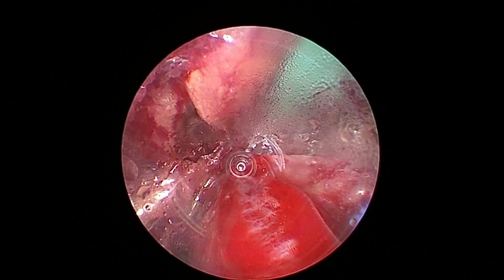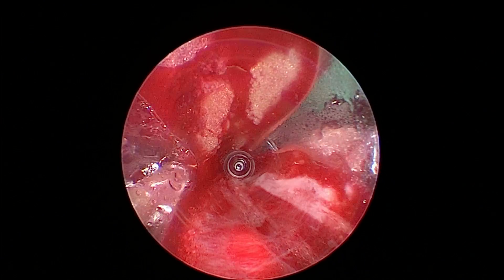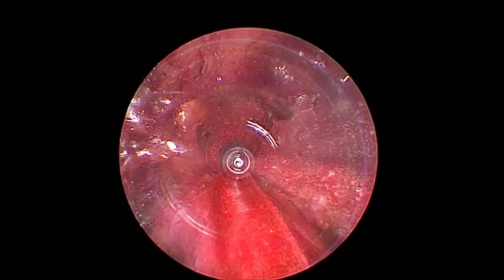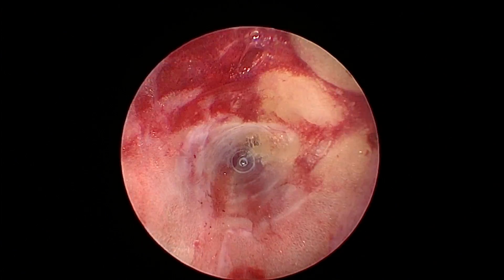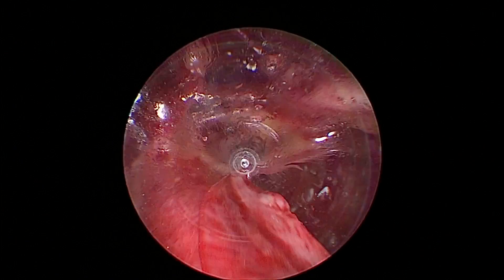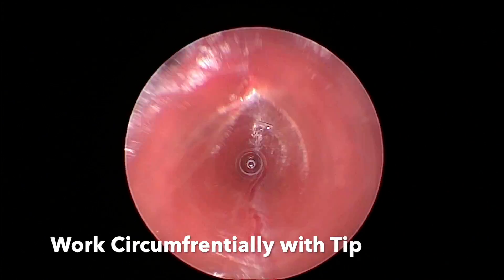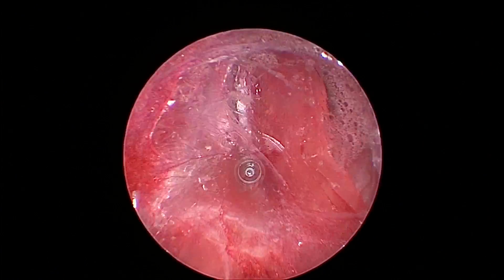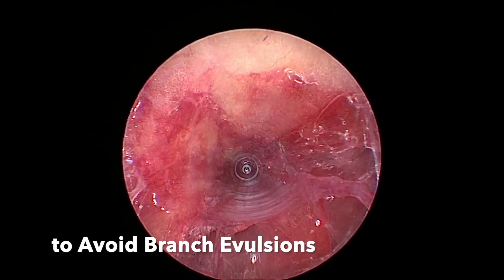I don't have a tourniquet up — I like to do this without a tourniquet. I do put a tourniquet on the arm just in case I get into some bleeding so I can put it up and see better. As you can see, I'm able to see all the structures I need so I can cauterize and cut the branches and take this as a pedicle. I'm working circumferentially with the tip — left side, right side — and this way I avoid any avulsions.